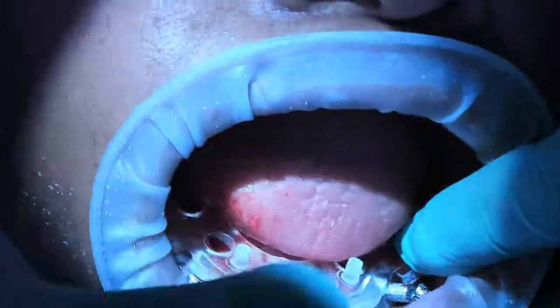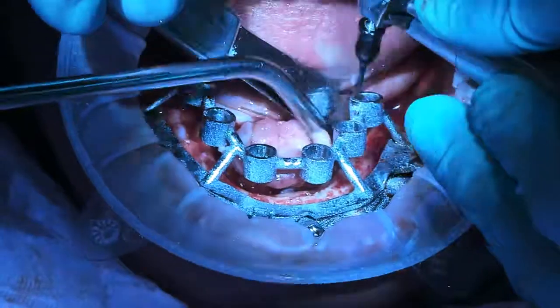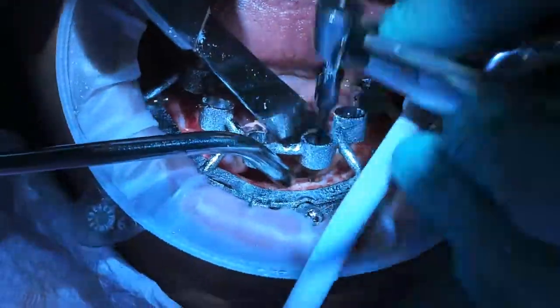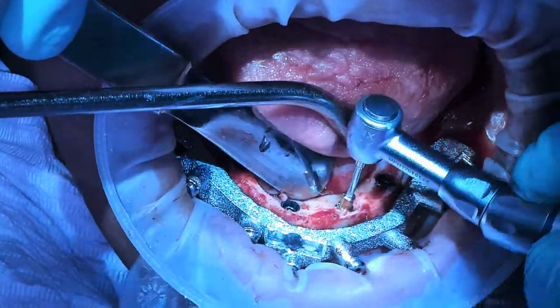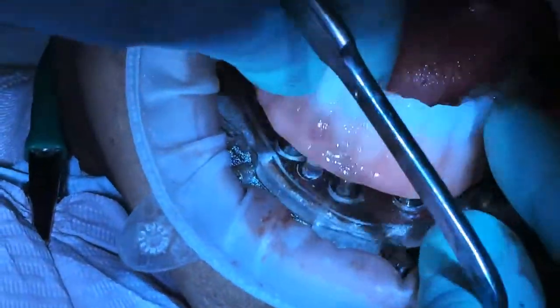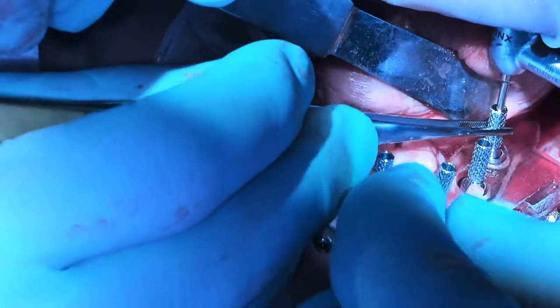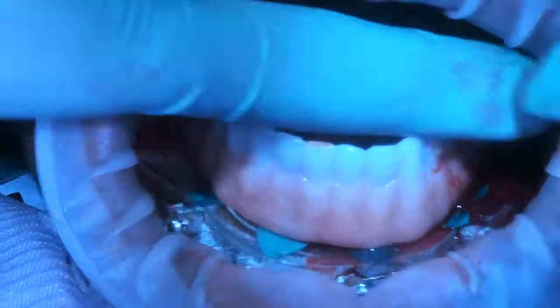Now that the mandibular fixation base is in place, the bone is reduced and the normal protocols are followed for chrome, which is bone reduction, try-in of the carrier guide, and then the abutments are placed, temporary cylinders are placed with the carrier guide in place, and then the prosthetic is picked up in occlusion, and the case is finished.